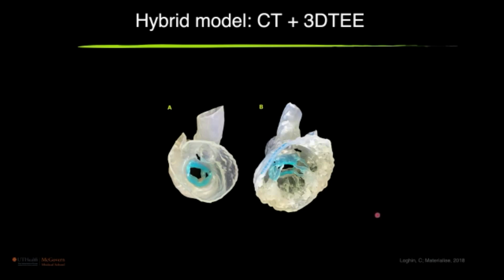And we recreated, along with the 3D printing company Materialise, with the help of their software, the whole mitral valve, papillary muscles, chordae, and leaflets. Whatever you see in blue comes from the 3D echo, whatever you see otherwise is from the CT data set.